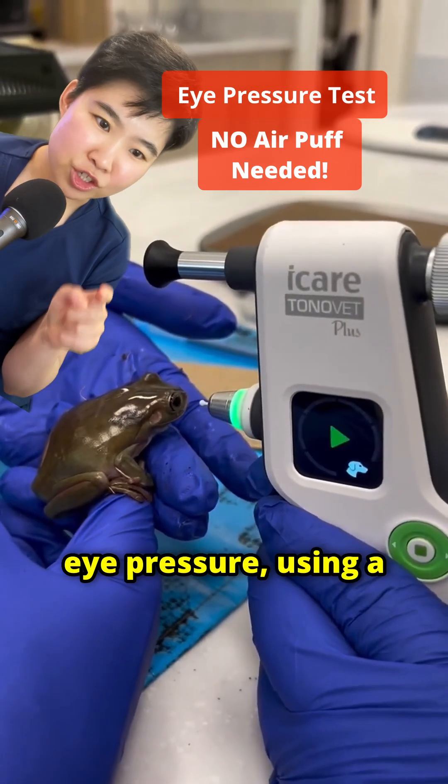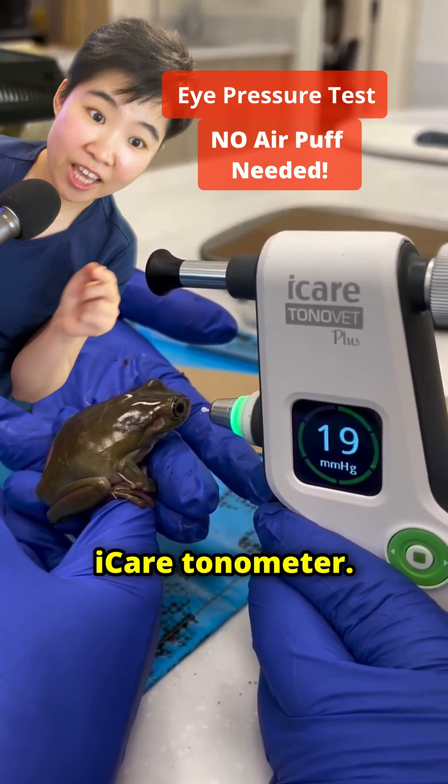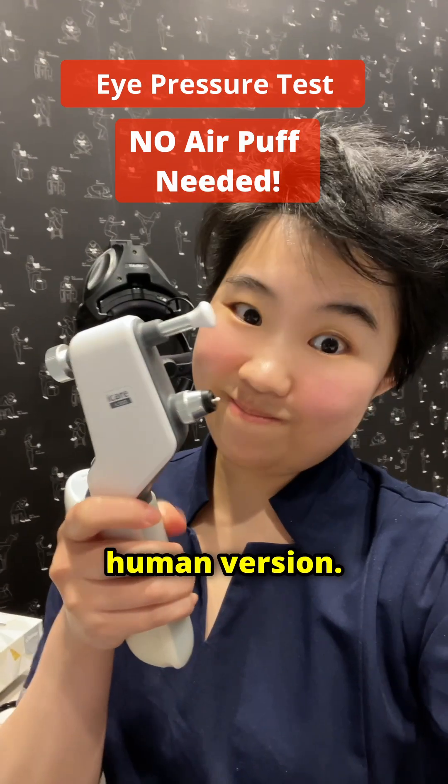They're taking this frog's eye pressure using a device called the iCare tonometer. And here's the human version.